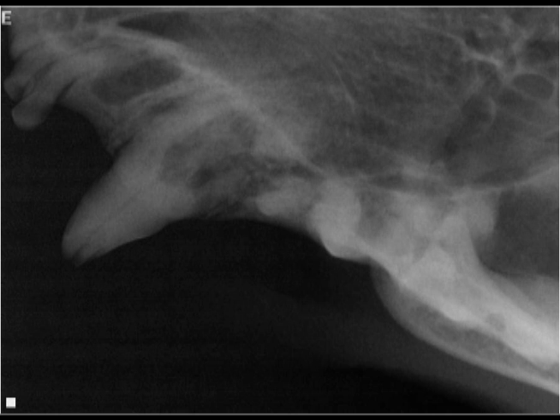In this radiograph from the previous patient, you can see the exposure of the root canal system shown by the white arrow. The severe bone and tooth resorption shown by the red arrows is obvious evidence of the significant infection this patient has been suffering. That is why any fractured canine in a cat is considered probable root canal infection.